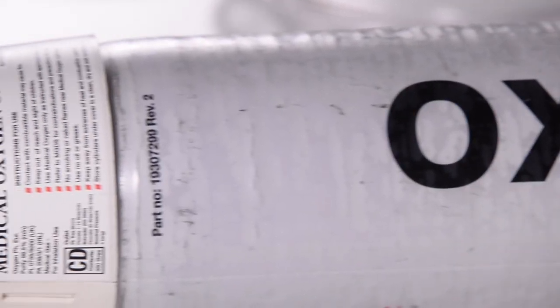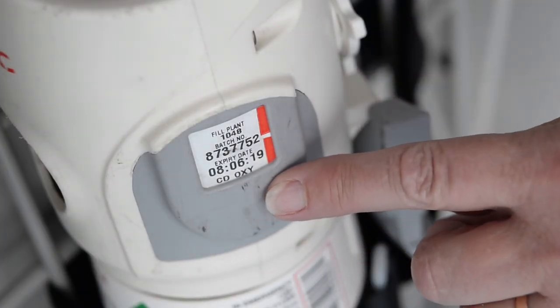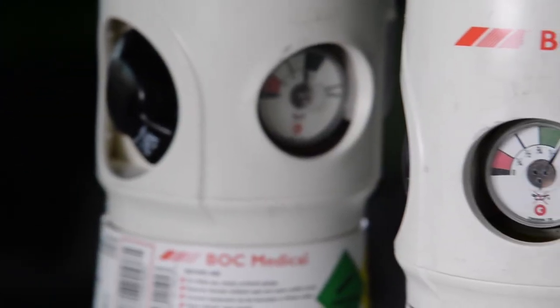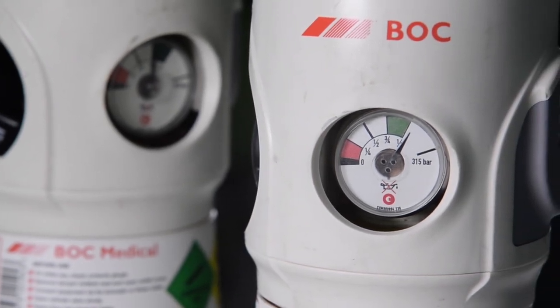Ensure you have the correct medical gas by checking the cylinder label. Check the expiry date on the batch label fitted to the cylinder. Make sure the contents gauge is in the green zone, which indicates that the cylinder is full.